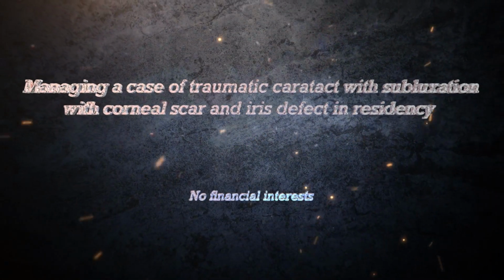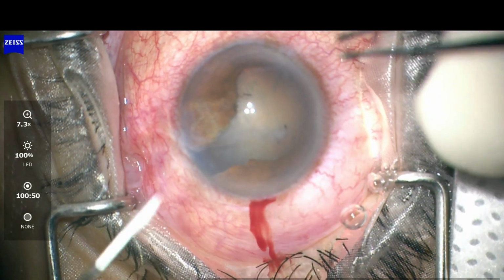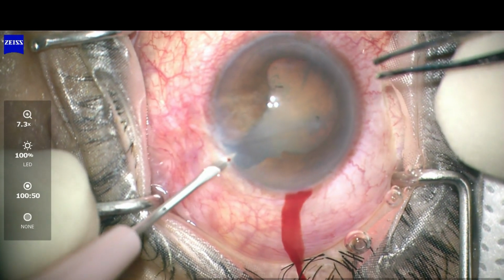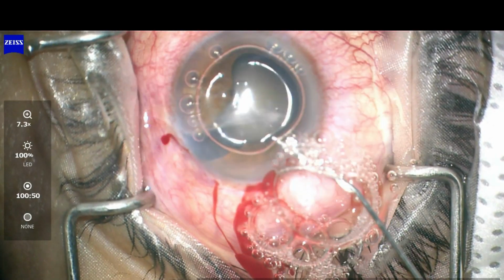This video demonstrates phacoemulsification in a post-traumatic cataract with subluxation with corneal scar and iris defect. As usual, a temporal 2.2 incision is being made and two side ports are made. Air is being injected into the anterior chamber.